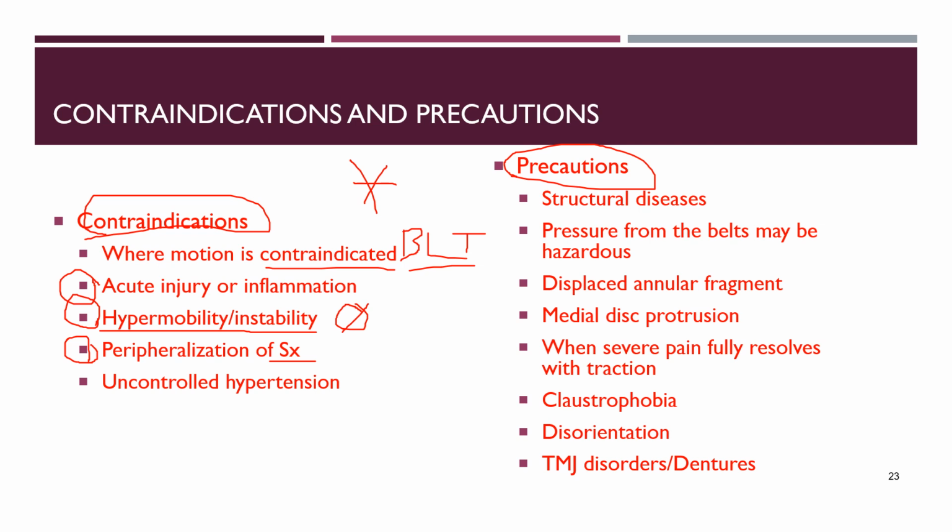If you put somebody on spinal traction and you're hanging out with them for the first few minutes and their pain is getting worse, as in it is traveling further down their leg or further down their arms, then that's a bad sign. That means we're causing compression somewhere else, which will give you more of those symptoms.